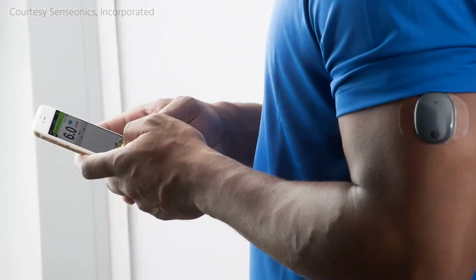What about the one that's actually under the skin? We have a couple of sensors that sit on the outside of the skin, and unfortunately, when you take those off, you need a new sensor. So it would be nice if you could plan the procedure at the end of the life cycle of that sensor. Or a lot of patients plan it so that if the procedure falls on day 3 of the sensor, they just delay putting a sensor in, and for those 3 or 4 days they might use finger pricks, so they can come home and then put it in. But if they come in with one on the outside, it's pulled out. It's got to go.